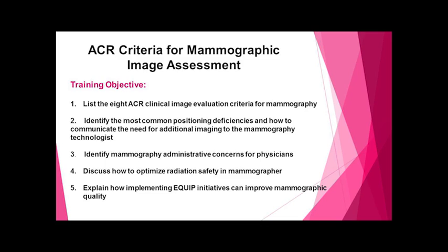Hopefully we'll be able to provide the interpreting physicians with some of the technical jargon that will help them be able to communicate effectively with their mammography technologists.